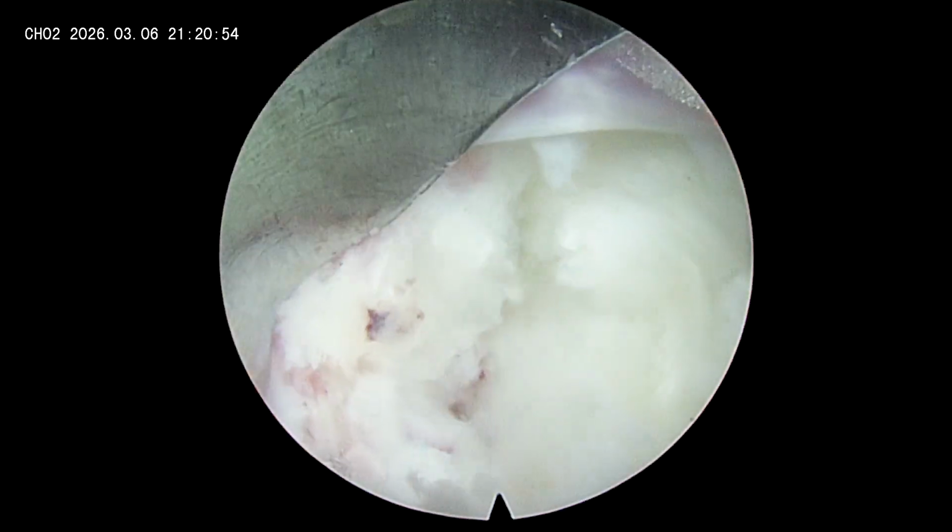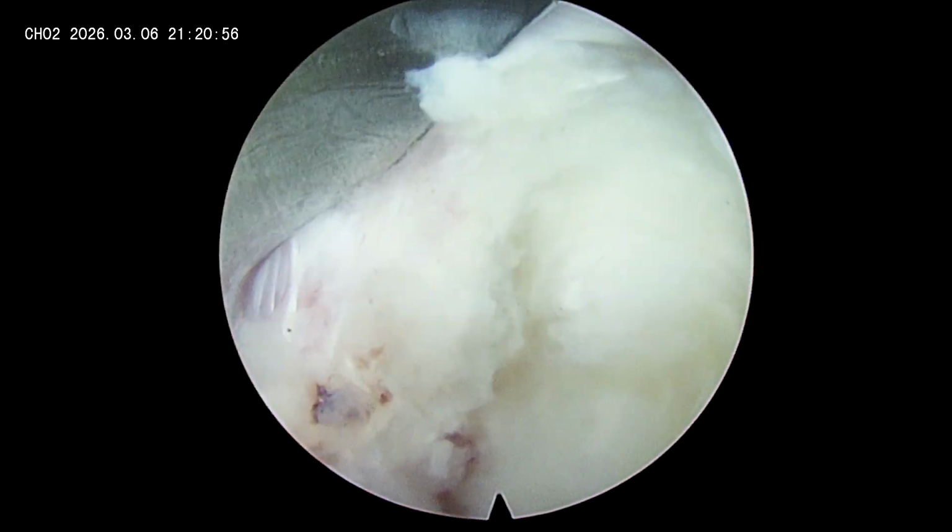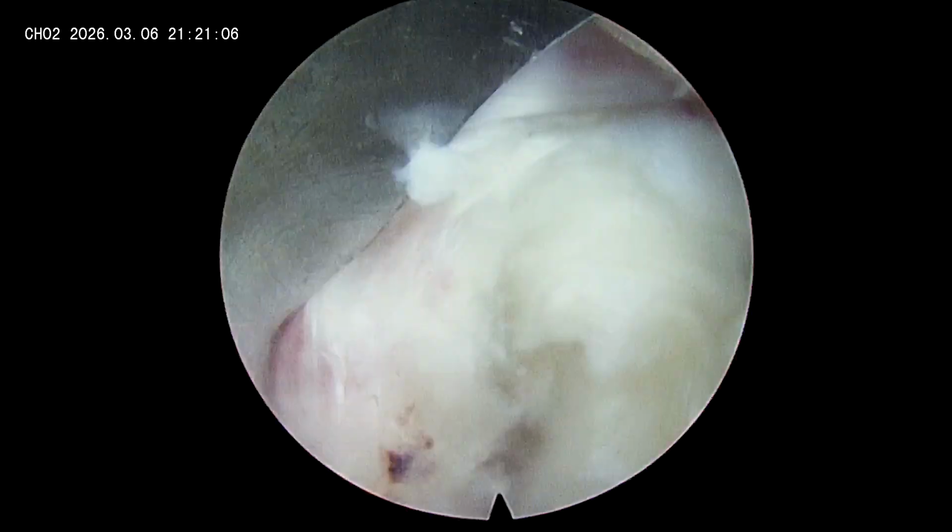Now everything is free. The traversing root is mobilized medially very nicely. There are no disc fragments inside. This is just a final exploration.